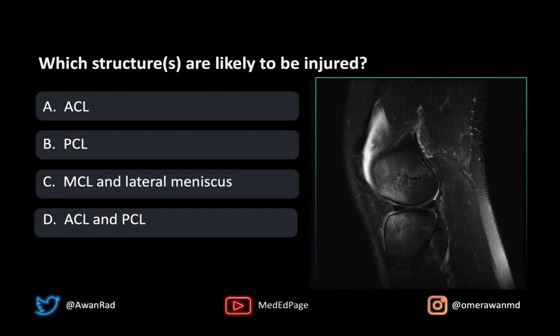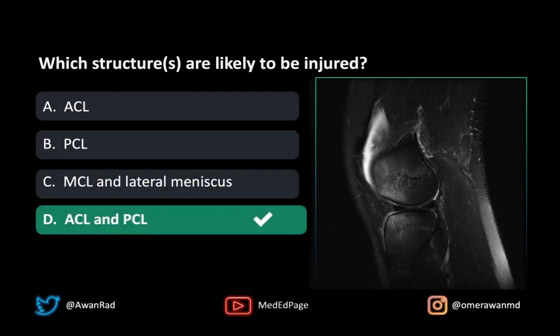Notice that you can't see the ACL, the PCL, the MCL, or the lateral meniscus directly, but you should be able to infer, based on this bone marrow contusion pattern, that this is a hyperextension injury and both the ACL and the PCL are going to be injured. So that's the answer here.